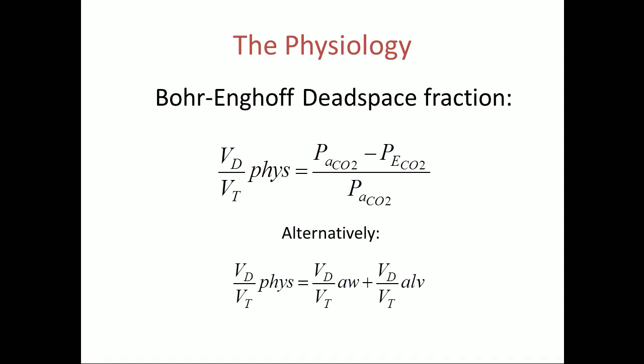And herein, I think, lies the problem as to why we don't measure dead space fraction. For those of you who've ever engaged with a Douglas bag, which is what you need to collect to calculate dead space, you can see it's cumbersome and just annoying. And I'd be happy if I never see another Douglas bag in my life.